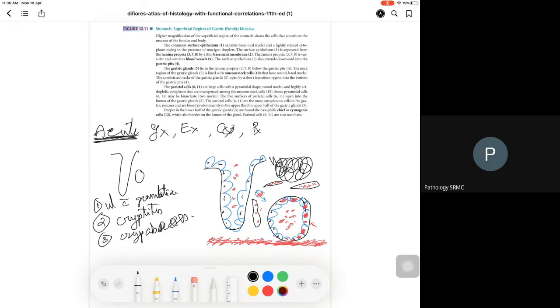These three are very important criteria for acute inflammation. Number 4, increased cells in the lamina propria as clusters. When it is scattered, it is not the criterion. They have to be as clusters.